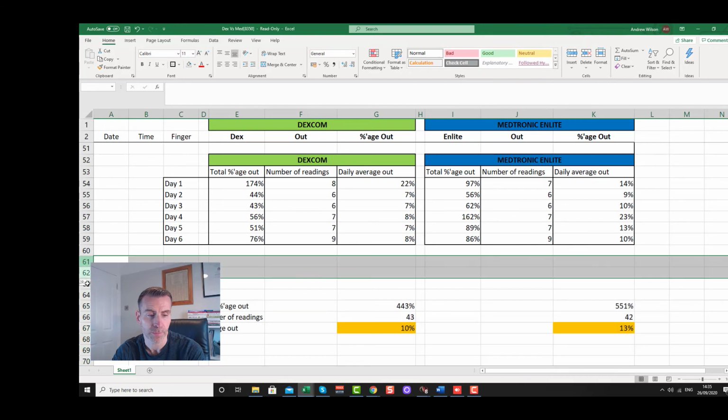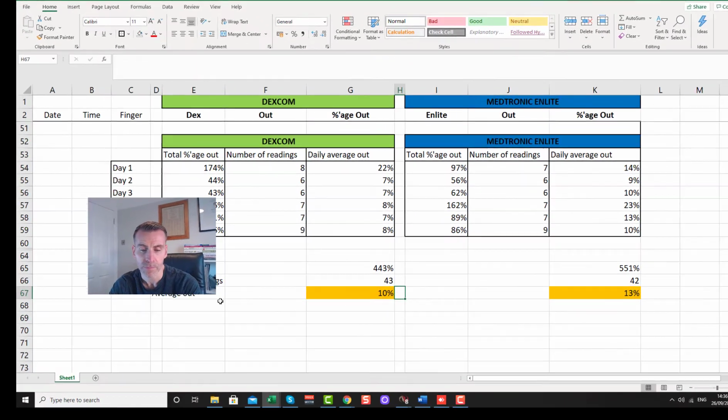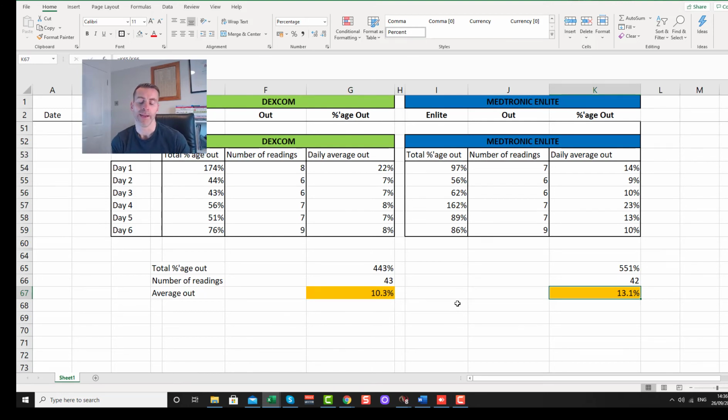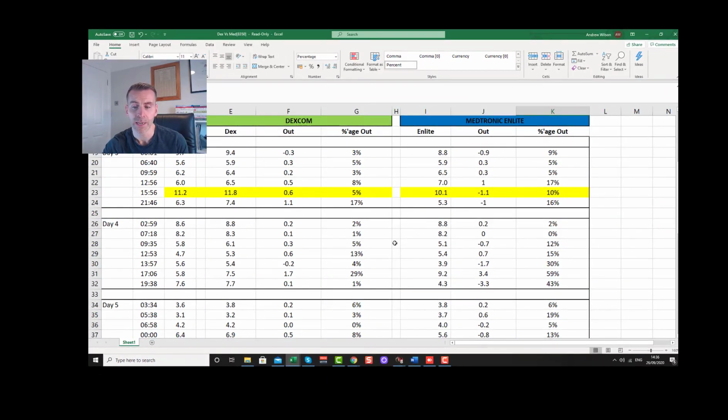The final piece of the puzzle is the total percentage out, 443 and 551, the total number of readings, and the percentages, 10.3% and 13%. Now, as I sit here, I think 10%, oh, I don't like that, or 13%, I don't like the fact it's 13% out. But in the grand scheme of things, mostly, we're not far off. We really are not far off.